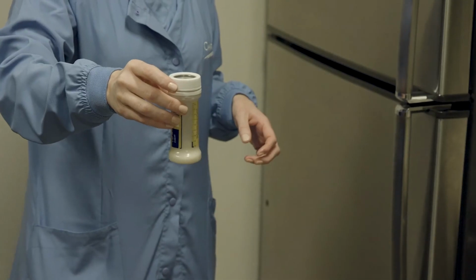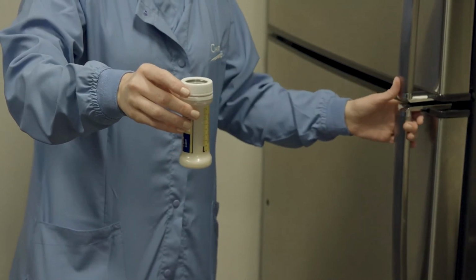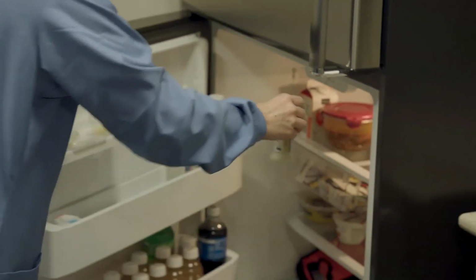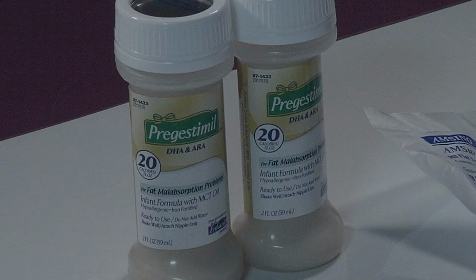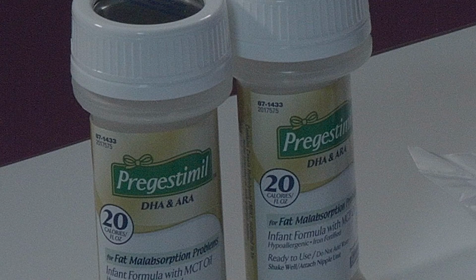Empty formula containers should be disposed of in your household garbage. Open containers of liquid formula can be stored in your refrigerator for 24 to 48 hours depending on the product. After 24 to 48 hours, open formula containers should be thrown away.